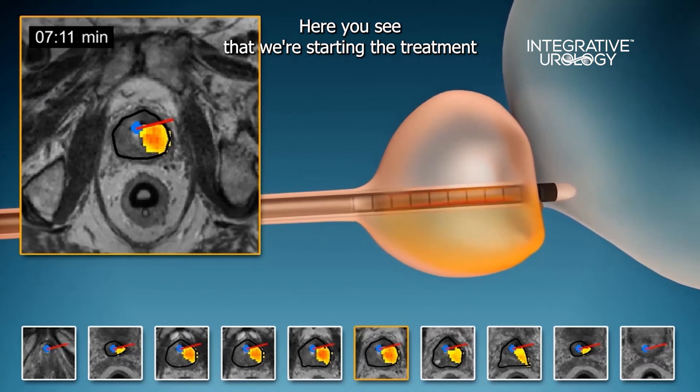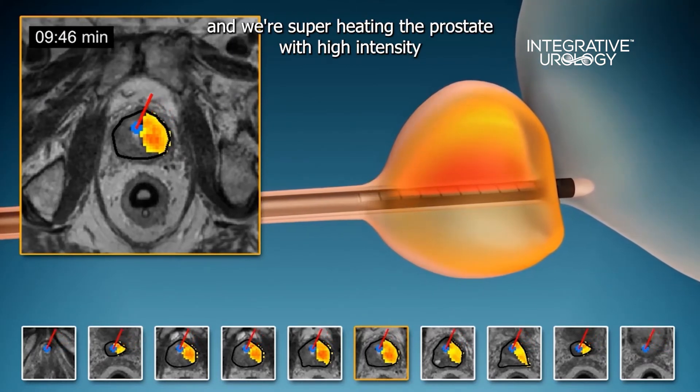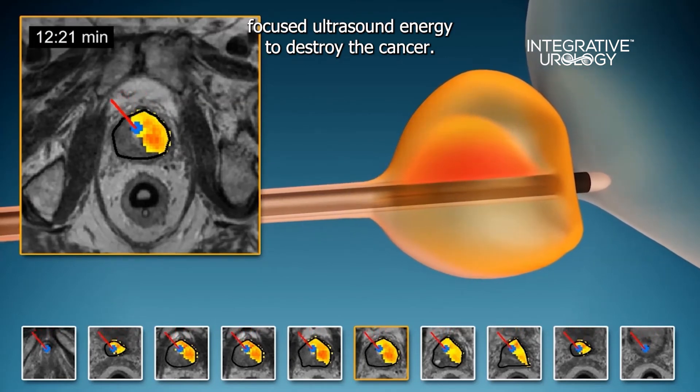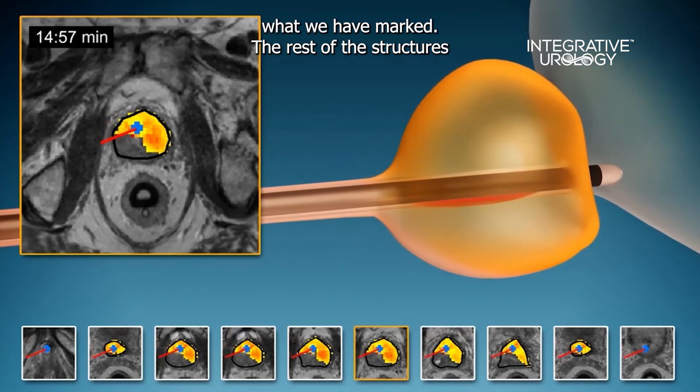Here you see that we're starting the treatment and we're superheating the prostate with high intensity focused ultrasound energy to destroy the cancer. You'll also notice that the treatment does not go beyond what we have marked.